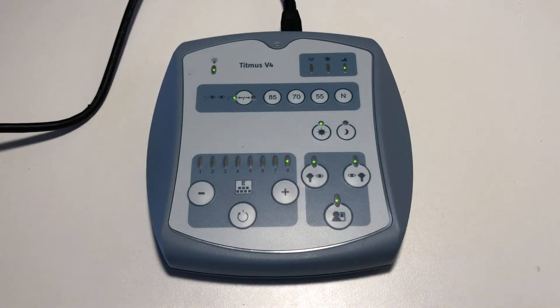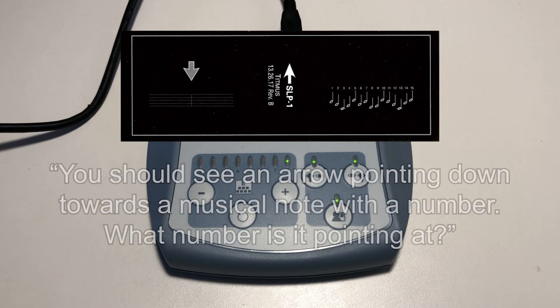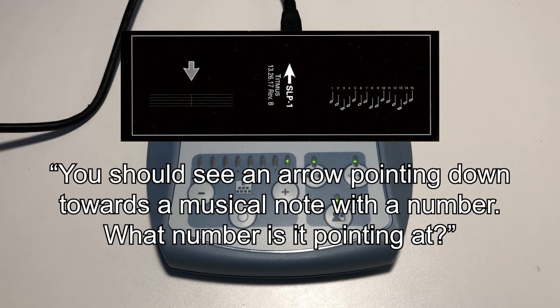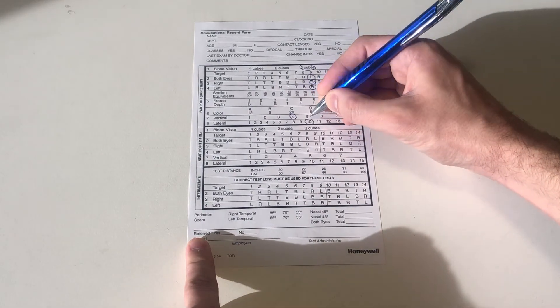Advance to slide number 8. This slide tests for horizontal phoria. Say to the patient: you should see an arrow pointing downwards to a musical note with a number — tell me what number it's pointing at. Record the number on the record form.